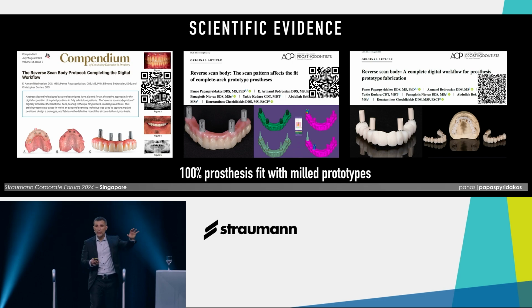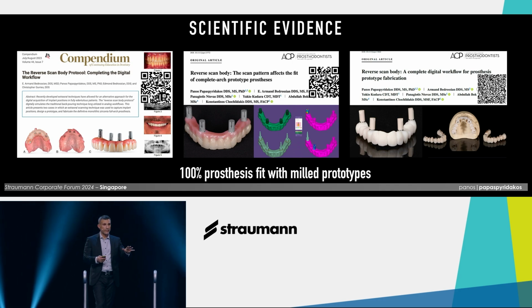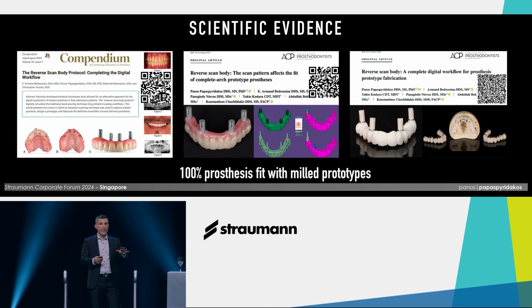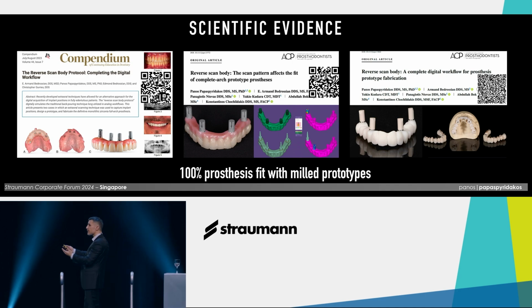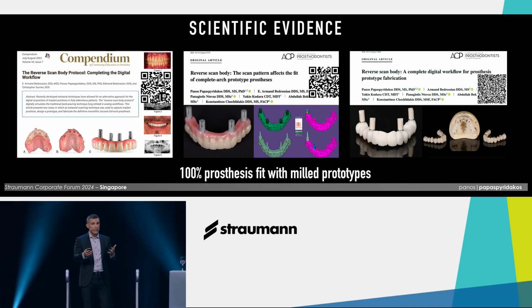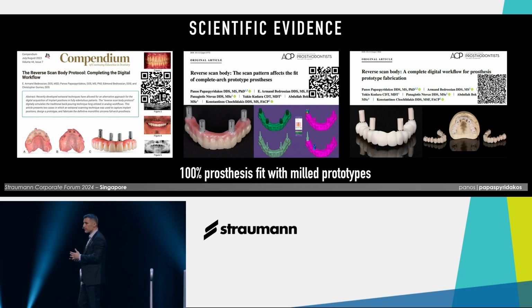Remember, with the previous digital workflow protocols, we had about 90. And 90 is high, but it's not 100%, which necessitates that you are careful, verify precisely before you implement the fabrication of the final prototype.